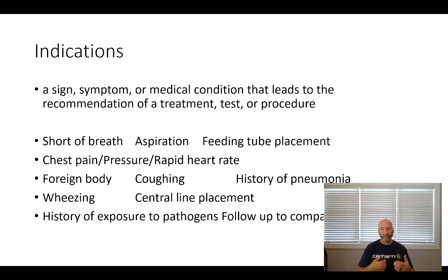Sometimes it'll hit some sort of, not really obstruction, but some sort of anatomy on the way down, and just kind of roll up in the airway, in the upper airway. So we might do a chest X-ray.